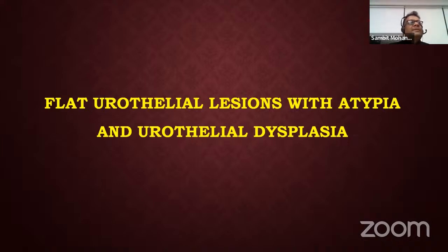Exactly. Because what happens when you look into the bladder biopsy? First of all, in the low power scanning, we see whether the lining is thickened or it is papillary. If you do not see any atypia, and it's just very, very regular urothelium, but the lining is more and there is papillary formation, you call it a papilloma or you say papillary hyperplasia. They are interchangeably used.